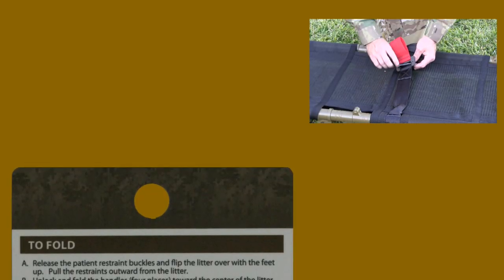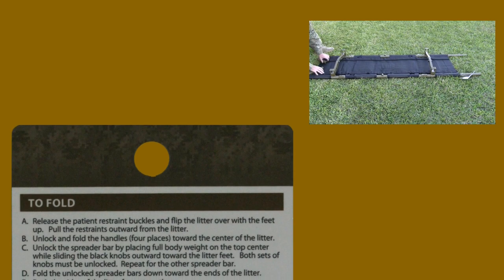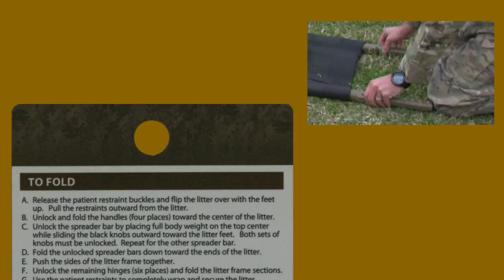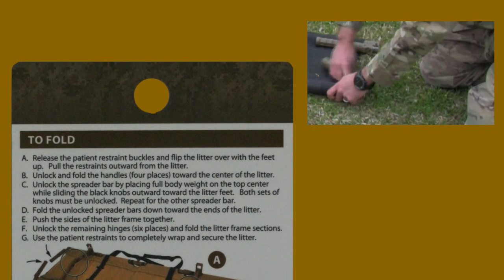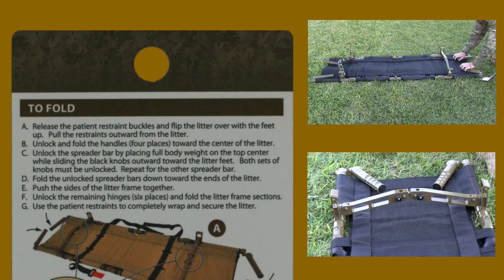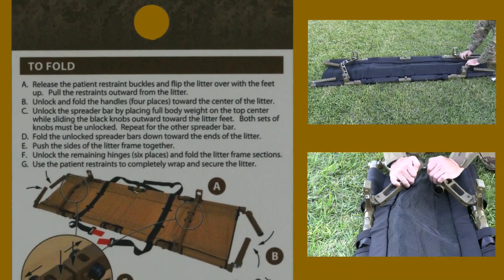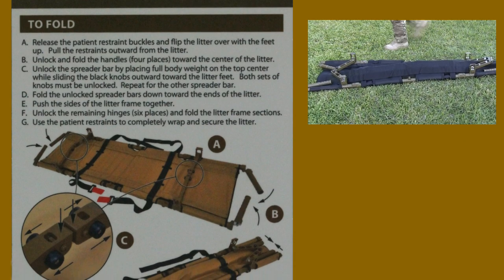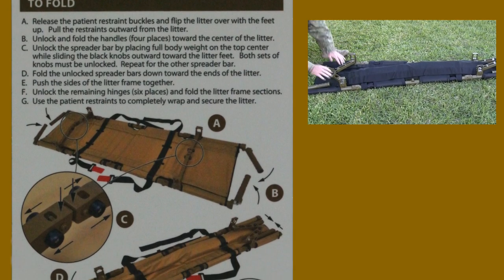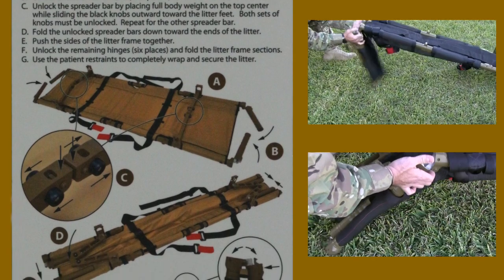To fold: A, release the patient restraint buckles and flip the litter over with the feet up. Pull the restraints outward from the litter. B, unlock and fold the handles — four places — toward the center of the litter. C, unlock the spreader bar by placing full body weight on the top center while sliding the black knobs outward toward the litter feet. Both sets of knobs must be unlocked. Repeat for the other spreader bar.